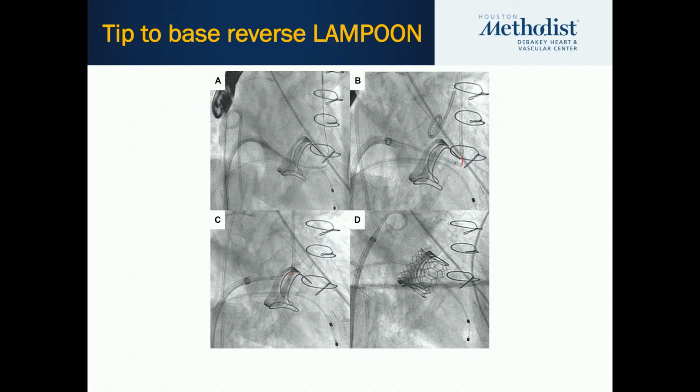A steerable guide catheter is positioned in the left atrium, through which we pass a balloon-tip catheter into the left ventricle, which is then directed to come out of the aortic valve, through which a Astato guide wire is advanced and snared in the ascending aorta. We create a veno-arterial rail, and then a denuded Astato wire is advanced through the venous side, in an insulated microcatheter called the piggyback catheter, and then a flying V is created.